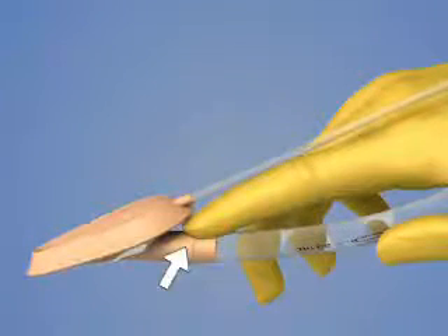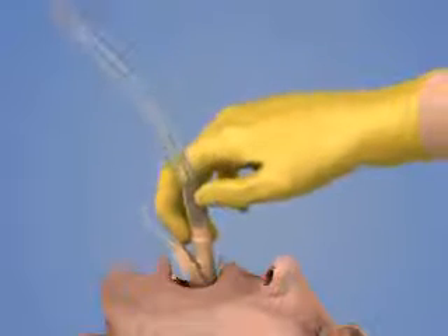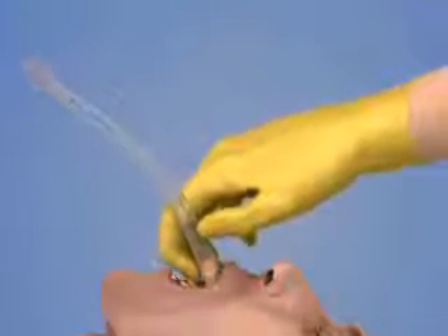Hold the LMA like a pen with the index finger at the junction of the airway tube and the cuff. Insert the LMA into the mouth and use your index finger to slide it along the hard palate and into the oropharynx.